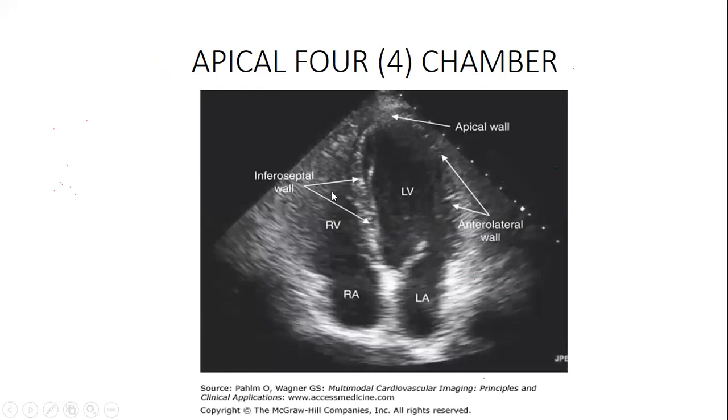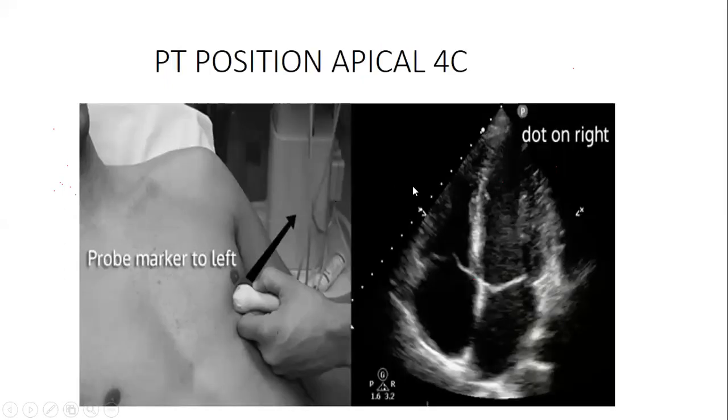Just a question on the previous slide. Okay, please. So this patient is in what position? Is it true supine or? Thank you for that question. I actually meant to explain that. Thank you for being attentive.